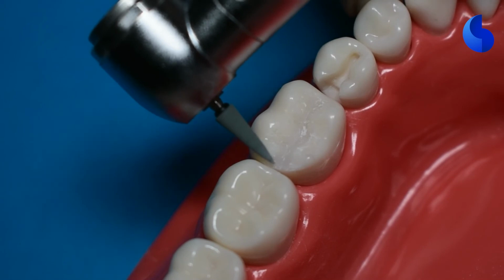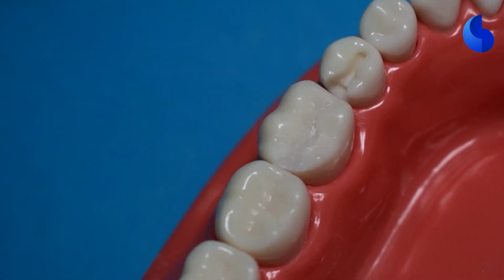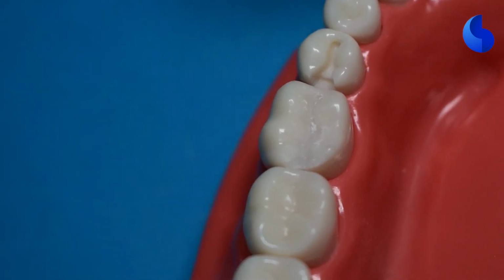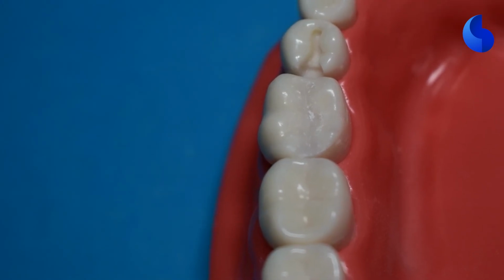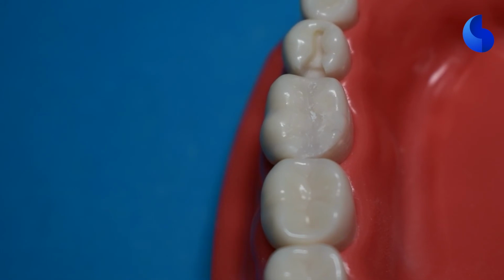that in the proximal box area, your marginal ridge is at the same height as the marginal ridge of the adjacent tooth, making sure that there is no excess material that is still left over, no flash that can be detected with the explorer.